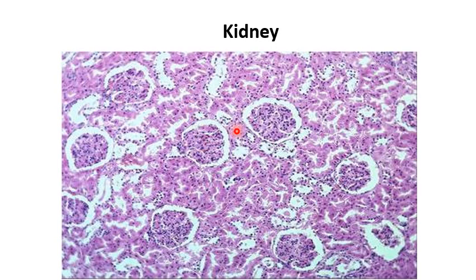If I see Malpighian renal corpuscles and tubules, it is kidney, and the kidney appears as a kidney-shaped structure.